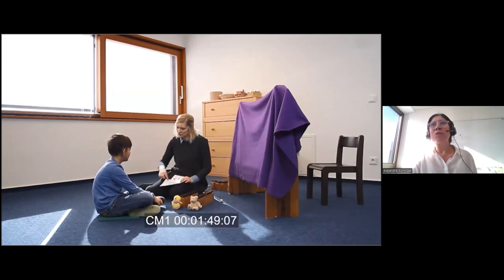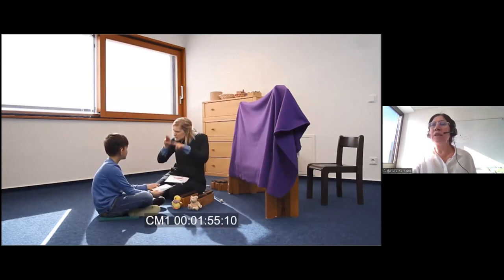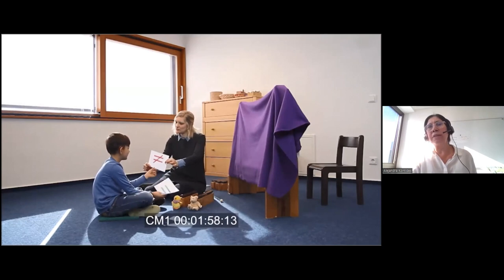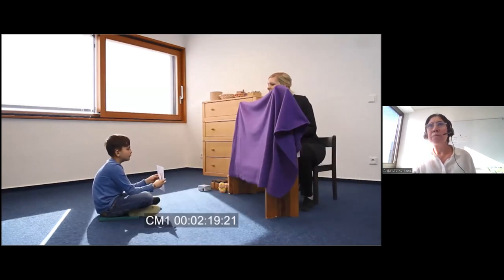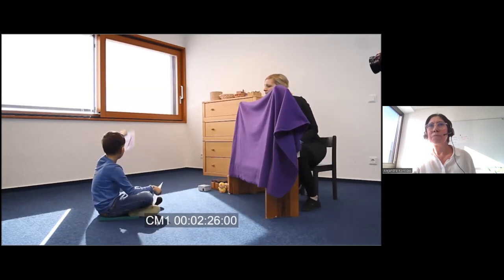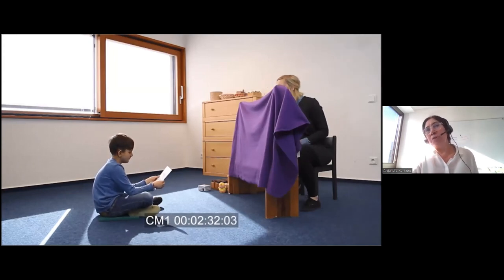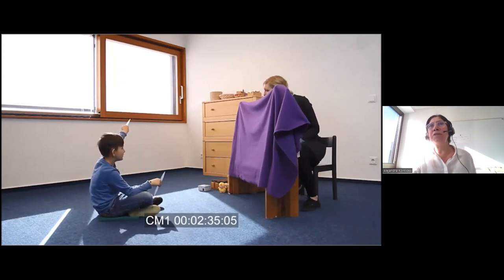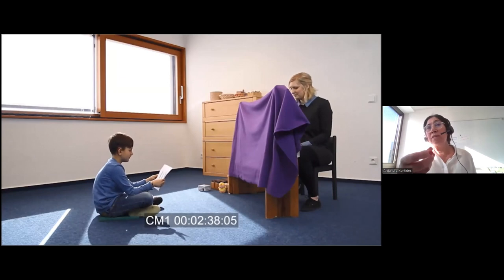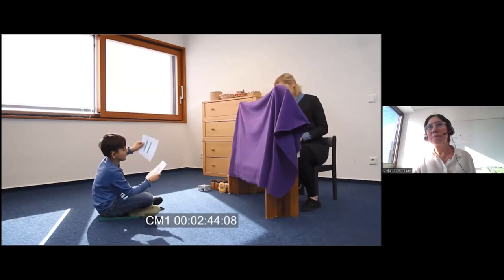Now we are going to see a little bit more complicated task. Melanie also showed the same with adults. So this child has to differentiate between two sounds that are going to be played, and he has to say if the sound is the same or if the sounds that he hears are different. Okay, Leo. Die ersten beiden Töne. So different. Is the same instrument, which makes the task a little bit more difficult, but this is the same as happened in speech when we have sounds that are similar, for example, sch. Die waren gleich. Super.